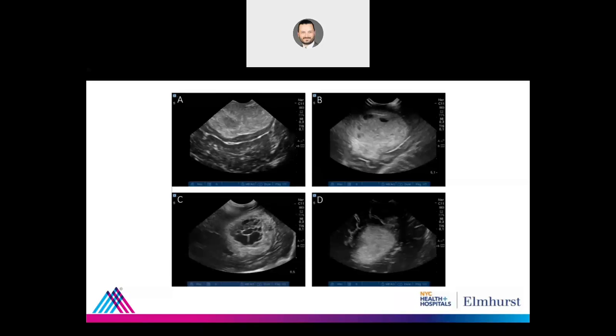What about the pilocytic, the juvenile pilocytic astrocytoma? Would that look like that? Usually the CNS ones that cause cysts are not as trabeculated like this. They're usually a small nodule and then a giant cyst. They usually look more benign. It's just one solid nodule. Yeah. Okay.